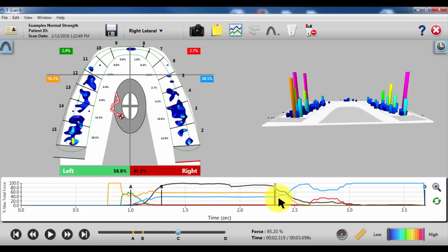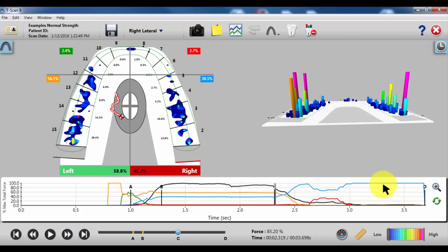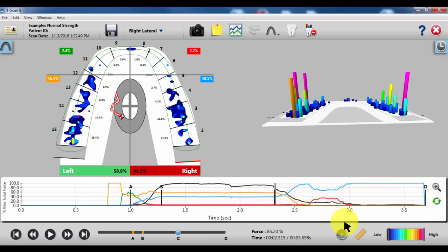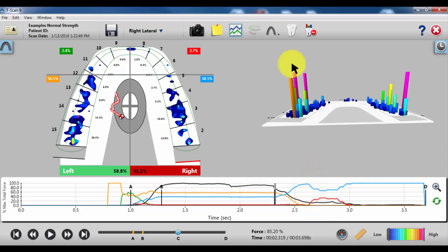Now we can evaluate starting at C. Just for defining the excursion, you can move the D line to the point where the person gets their anterior guidance. In this case, you can tell they're not going to get much anterior guidance. The D line is probably, if you want it to be technical, since you never get it, it would start all the way back here. That can be a problem because the patient then has such a long time to exclude, has more opportunities for interferences, and creates symptoms in the muscles of the jaw that could relate to TMJ.